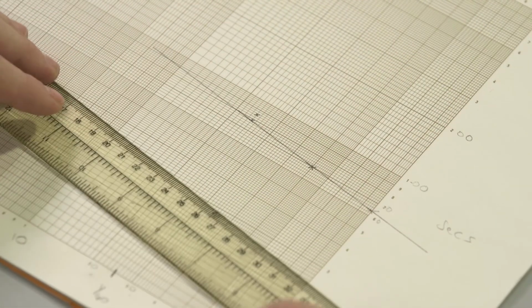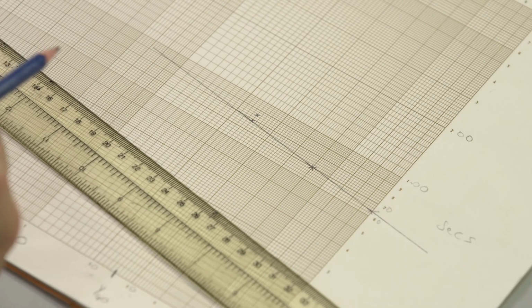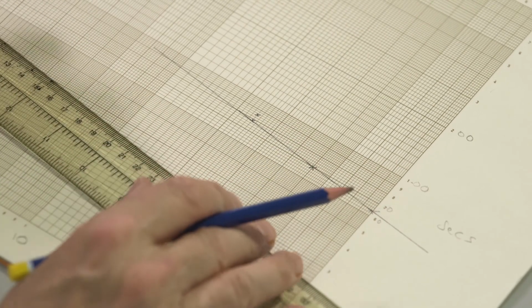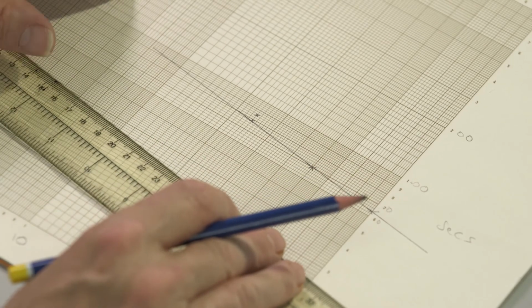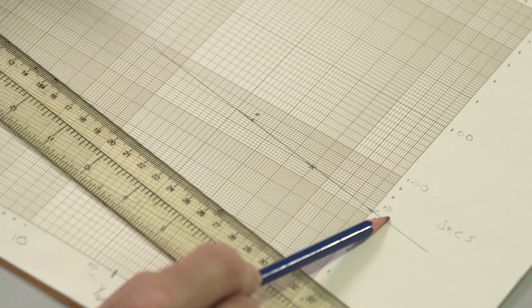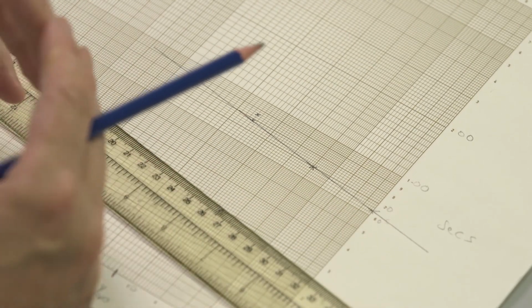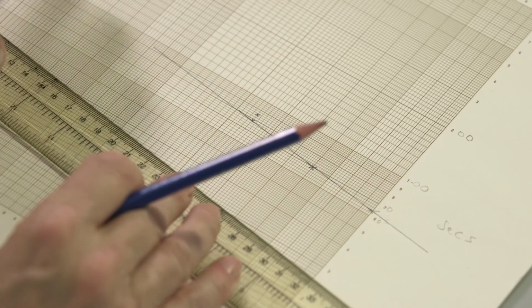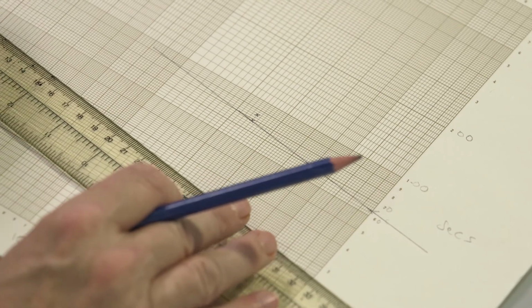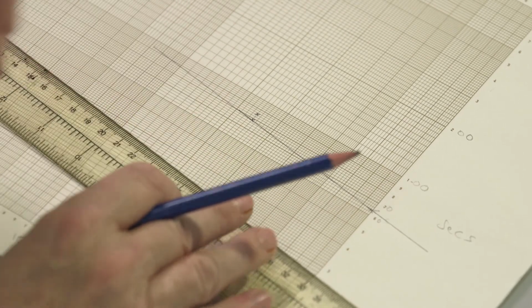through those points, is it a straight line relationship? Yes. Is every point exactly on the line? No, it's not, and that's typical of this type of assay. I think there's an error in the 85 seconds. 5 of the 6 clotting times, taken together, form a good straight line relationship. I think that's sufficient. If these were patient samples for patient management purposes, I would be, at this stage, saying I think it's safe to proceed to make calculations next on the IQC material. So I think the error, whatever it is, has occurred with the 85 seconds.